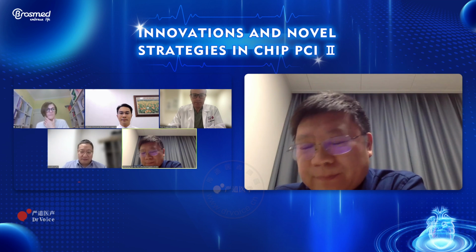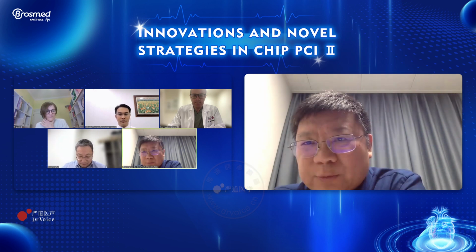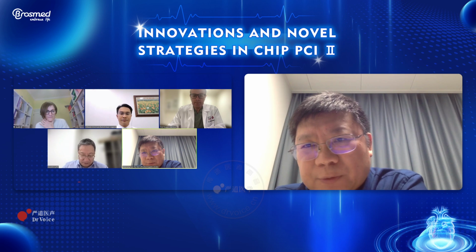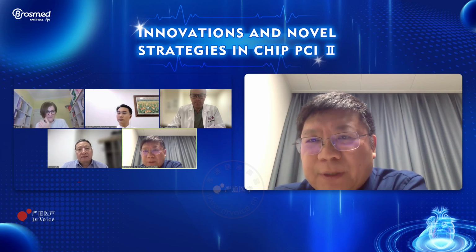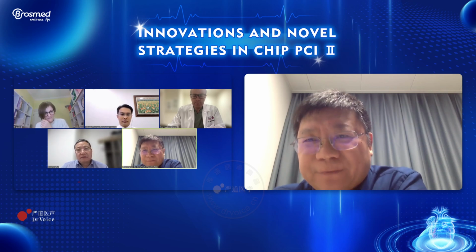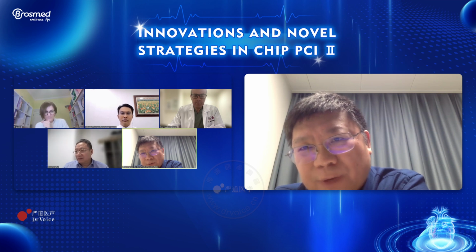Professor Routledge has presented two very nice cases and two very special cases. Sometimes for this patient, it is very difficult to engage the guiding catheter to the ostium of both the right coronary and the left coronary. Especially for the first patient, because the stent protrudes to the ostial RCA.